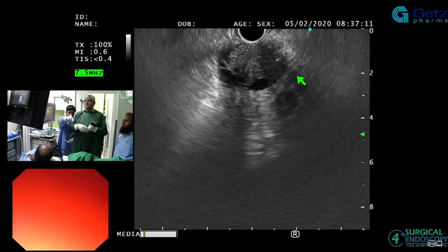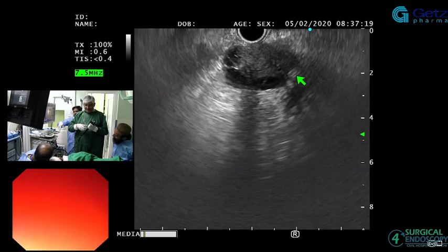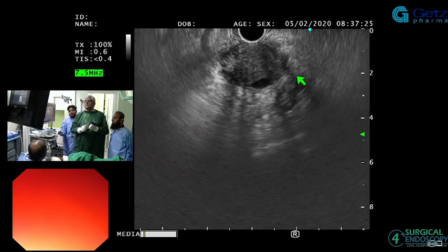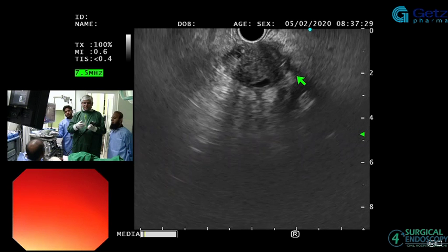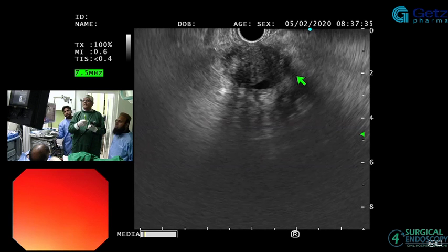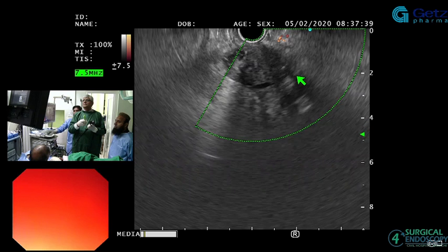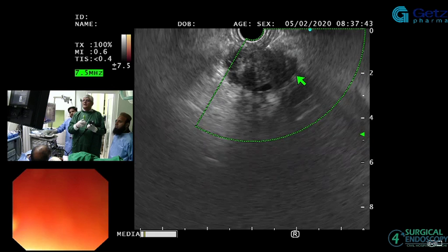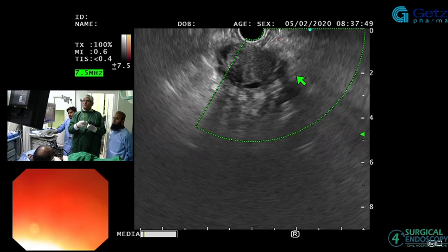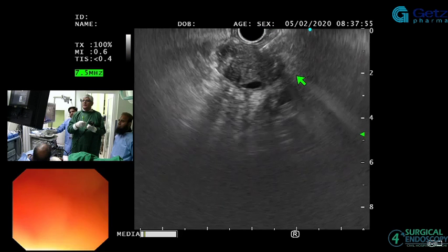The threshold that we have, I like it here. So everything is good. What I was telling you is that I took this off. If you want to, you can lock things. Okay, so we are good. Needle is coming out. We are fine, right? And there is no tightness that I feel. I've got it at almost 90 angle. Take the flow off, please. I went into it, but slightly sideways. So I'm just going to bring it more here, and we are in.